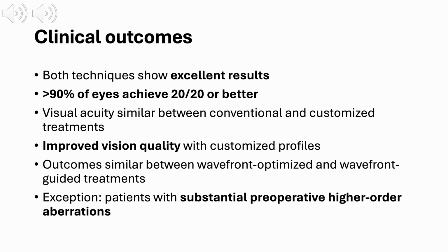In other words, if you only measure Snellen acuity, you often won't see a dramatic difference. Where customized treatments begin to separate themselves is in quality of vision, not quantity. Patients treated with Wavefront-optimized or Wavefront-guided profiles tend to report better contrast sensitivity, fewer halos, and fewer night vision symptoms, especially under mesopic or scotopic conditions.